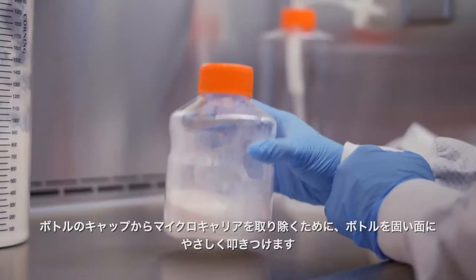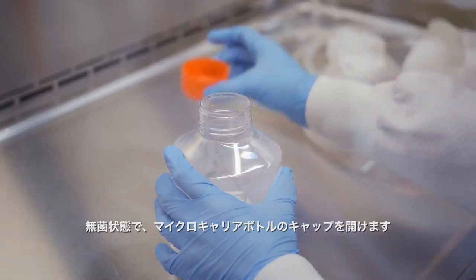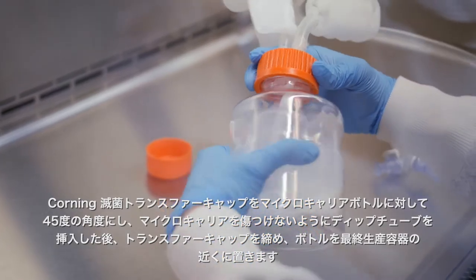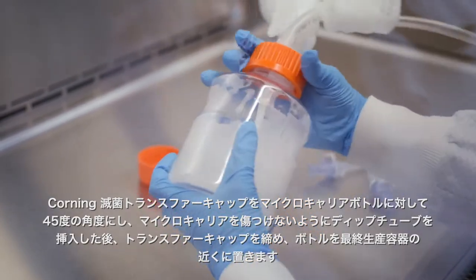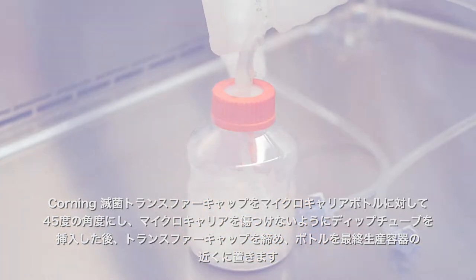Gently tap the bottle on a solid surface to dislodge the microcarriers from the bottle cap. Aseptically remove the microcarrier cap and insert the dip tube from the Corning aseptic transfer cap. Hold the microcarrier bottle at a 45 degree angle to prevent the dip tube from damaging the microcarriers. After the tube is inserted, tighten the transfer cap and place the bottle near the final production vessel.